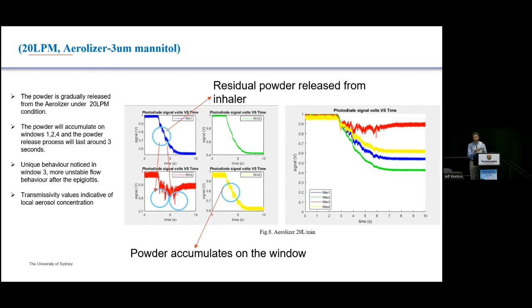What we're working on now is understanding how we can relate that information to a useful quantitative metric. There are experiments where you have to do calibration in a variety of ways to relate the local mass fraction to what you're measuring from the laser attenuation experiment. Again, if we go back to CFD, this is giving us a real-time dynamic picture of the deposition fraction, or at the very least, the time of flight of the aerosol inside the airway. That's something you can measure quite easily because it's all synchronized and triggered to the initial breath for whatever inspiratory profile you want. So you can measure exactly how long it's taken for the aerosol to cross from one region to the next. It's a very simple method, which would enable CFD models to be validated in the region where they're being used.